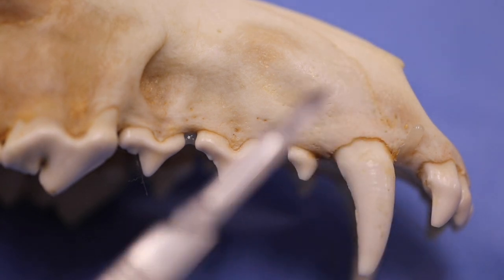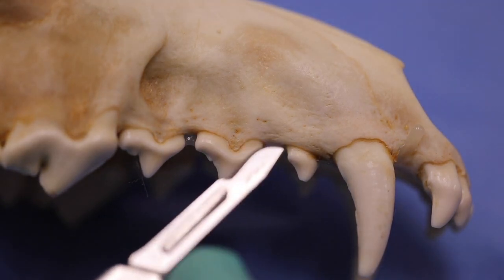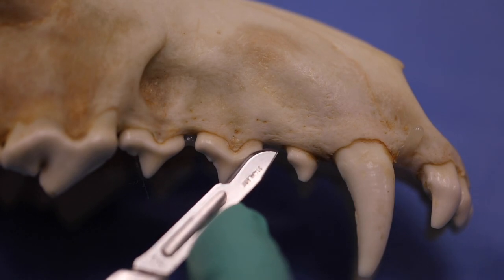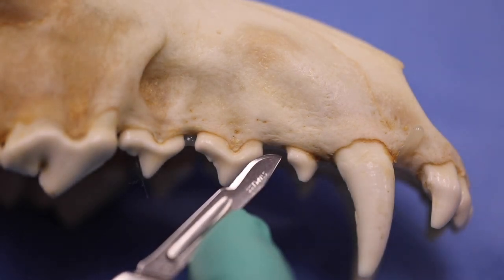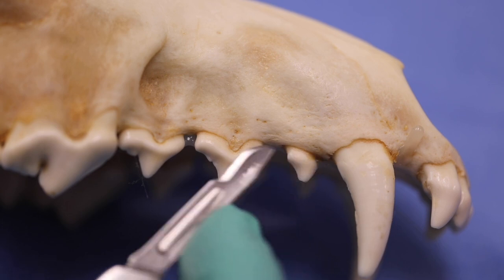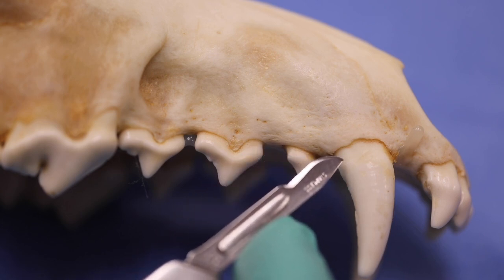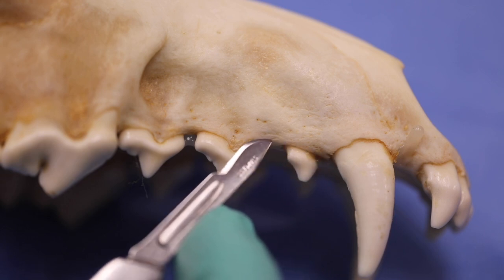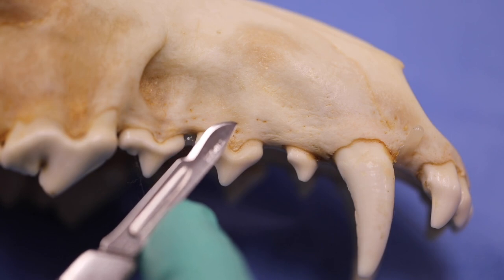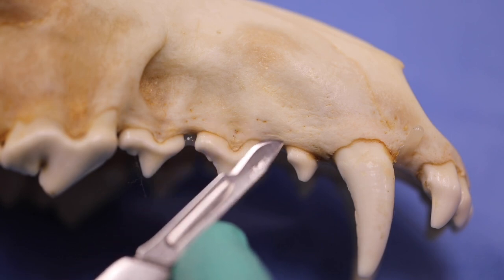And one thing that we can't do is have that scalpel parallel to the tooth, and that's the thing that we actually gravitate to naturally, to have it like this, parallel to the tooth. And in reality what happens is it slips off the bone and we'll rip that flap before we even get our periosteal elevator out to start to elevate.